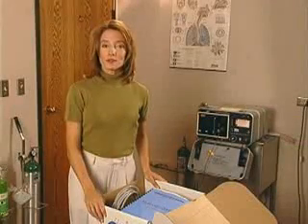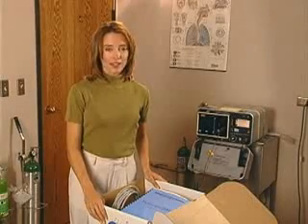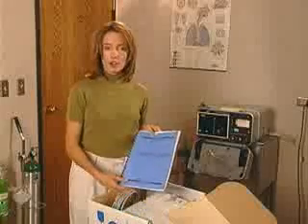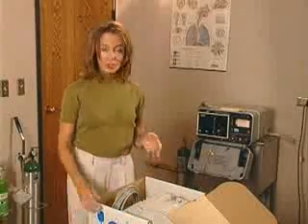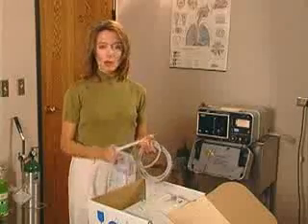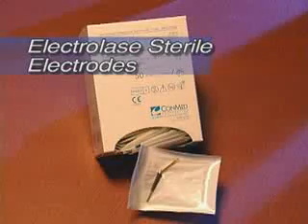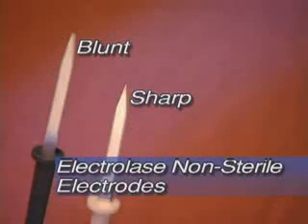Now that you've opened the box, let's go through the contents. Your Conmed Hyfercator 2000 comes packaged with a variety of items: a warranty card and operator's manual, the unit itself, the remote control power pencil, the power cord, and a wall mount kit. Other Conmed accessories available through your local medical distributor include Electrolase disposable electrodes, blunt and sharp.